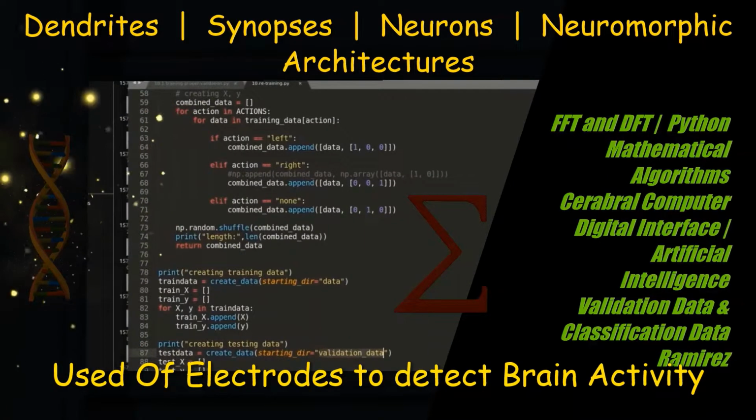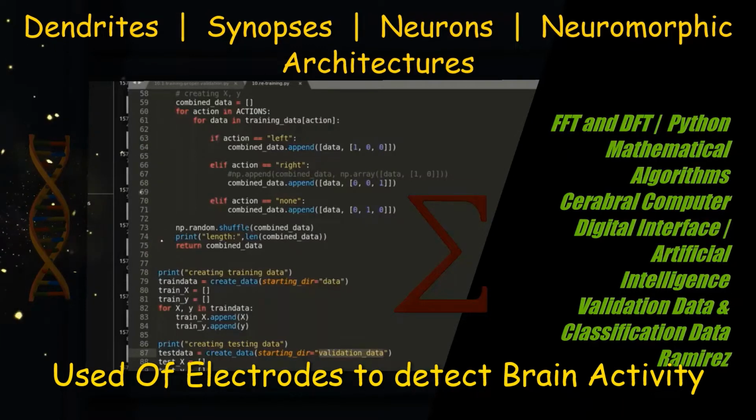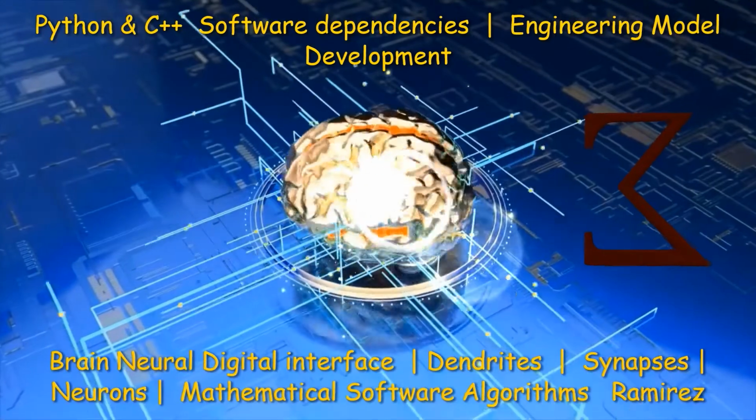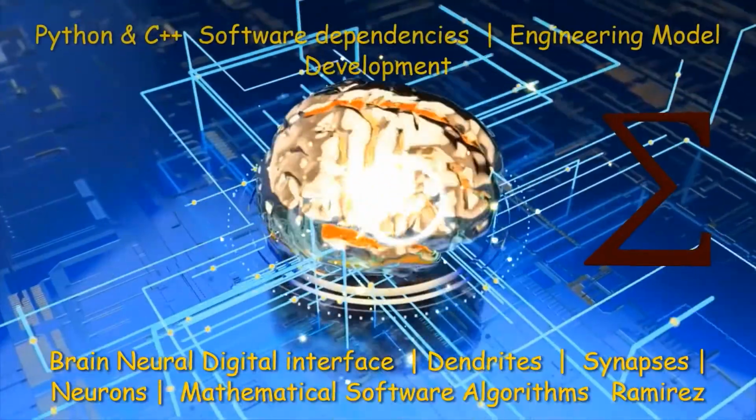The EEG system detects the signal created when populations of neurons are active at the same time. It typically records signals from small areas of the brain surrounding each electrode.